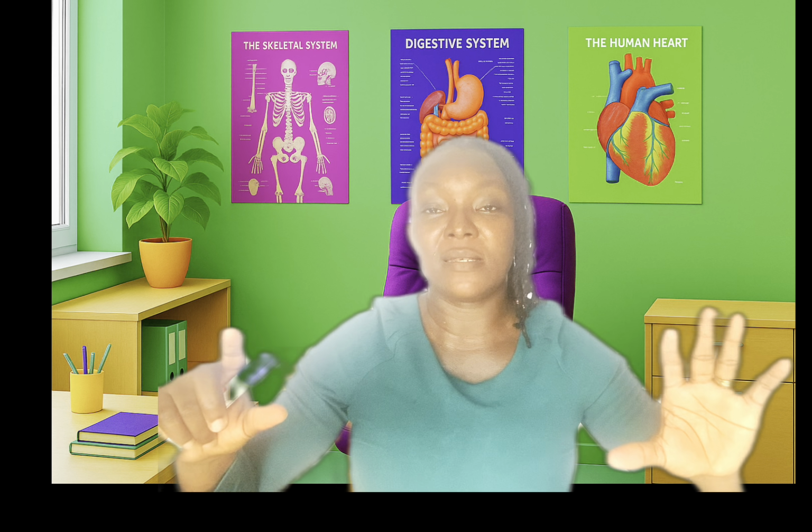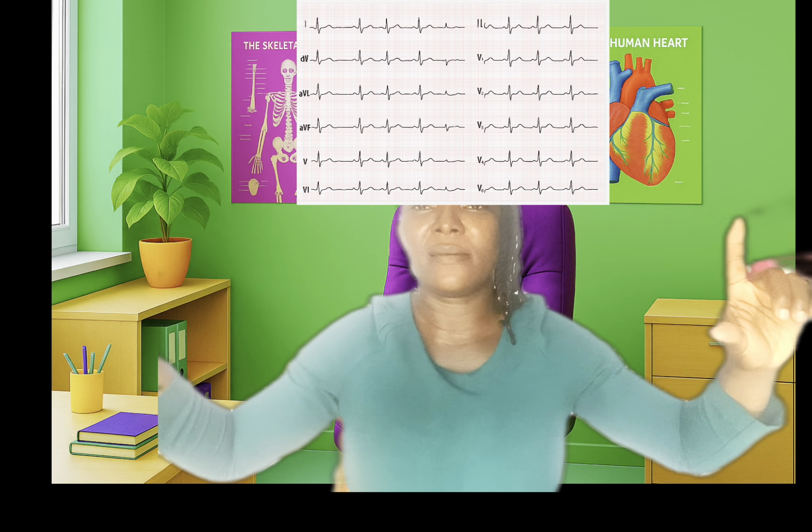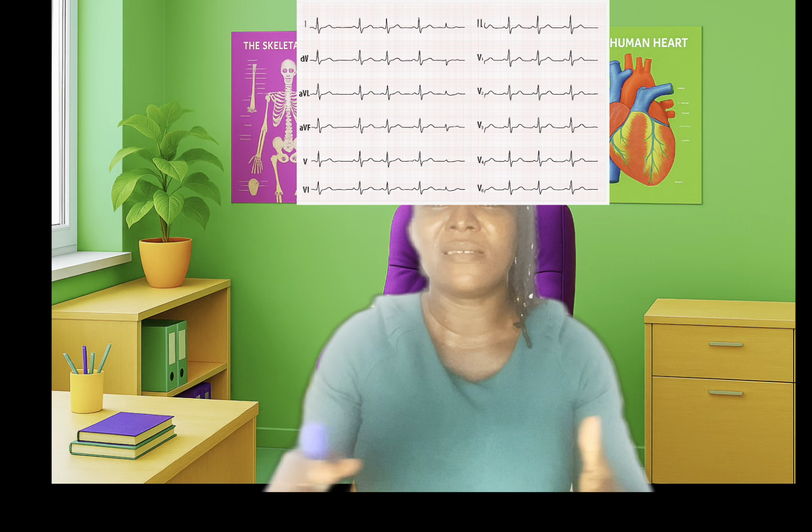All right, guys. So when we take an ECG paper, we see a lot of leads, right? What we call the 12 lead ECG paper that looks like this. You will see 12 different lines. Some are represented by alphabets, some by Roman numerals and all that. What do they stand for? In this video, we will delve into understanding our 12 lead ECG and what each and every lead stands for.